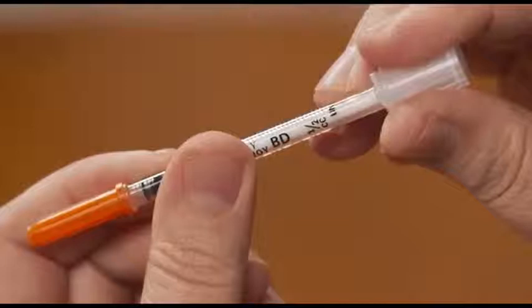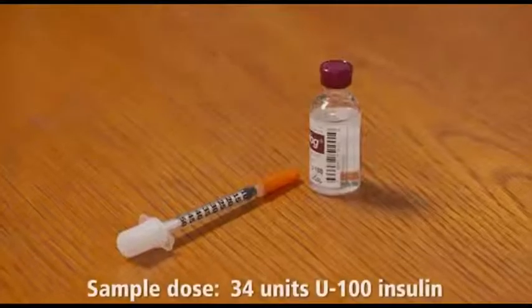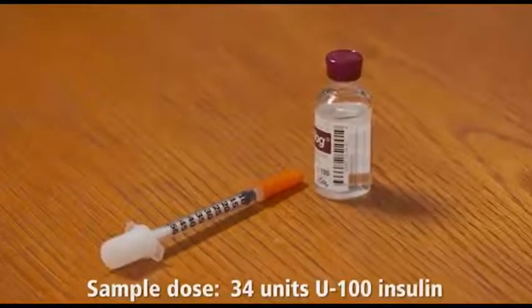For this demonstration, I'll be using a half milliliter BD insulin syringe with the BD ultrafine 6mm needle, and I'll use a dose of 34 units of U100 insulin. This is only an example, so be sure to check with your doctor to determine the syringe and the dose that are right for you.